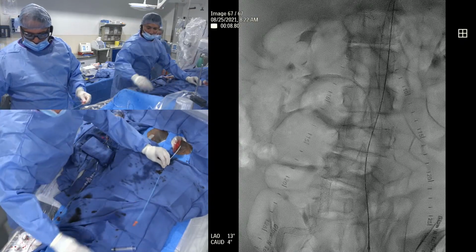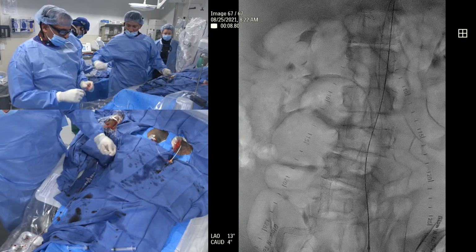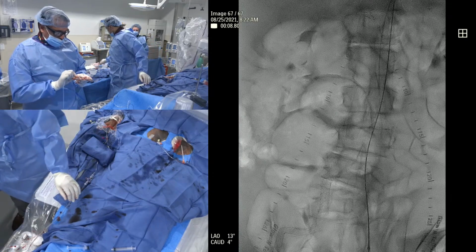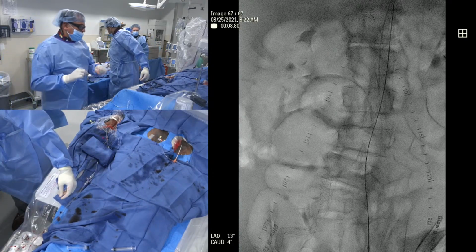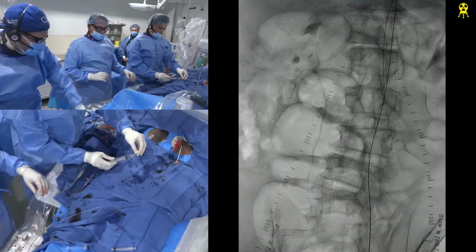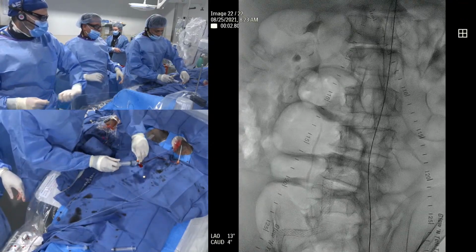This is flush, Luke. Yeah, flushed. So we're going to go with the Spartacore here. Don't lose the wire. Yeah, one second. So now this IVUS is going to tell us a lot, Rob, and it's going to tell us how the ostium is involved and how we should approach it. If the ostium is truly involved, then we might have to use some of the coronary bifurcation techniques that we've had in the past in order to be able to do this.